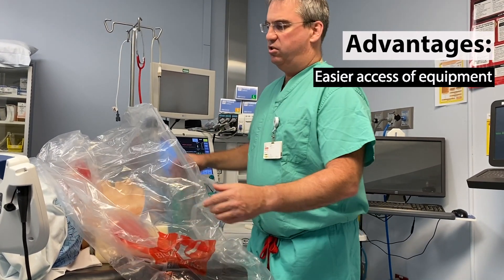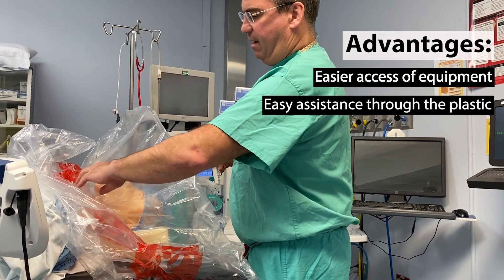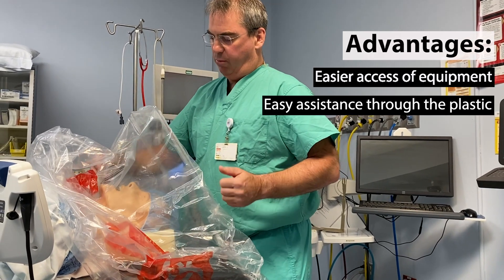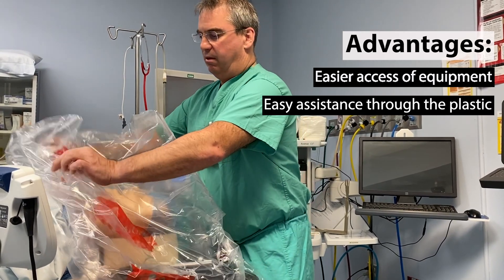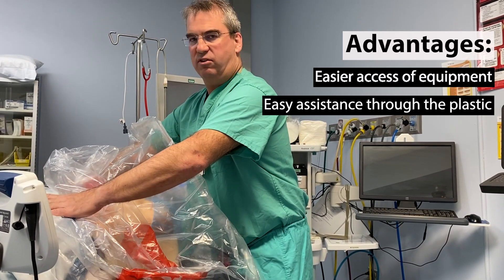The second advantage is that once the patient is draped, another provider without getting contaminated can help you and assist you easily through the plastic. They can see what you're doing — they could give cricoid pressure, pull on the lip, pull the stylet out, and everything here would be contained. They're also advantageous because they can use the plastic, which is clean, and listen for breath sounds.